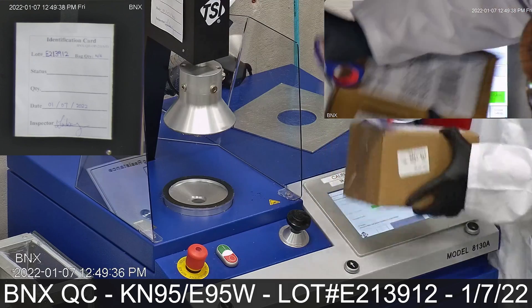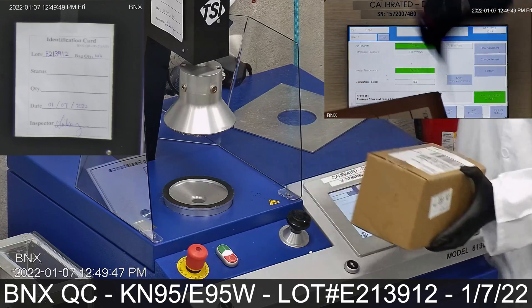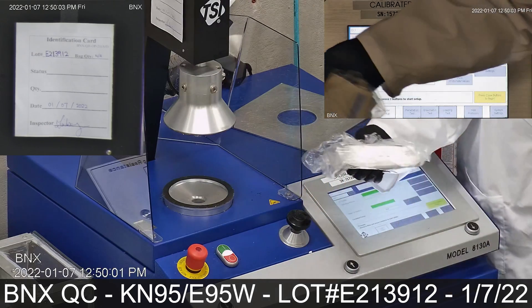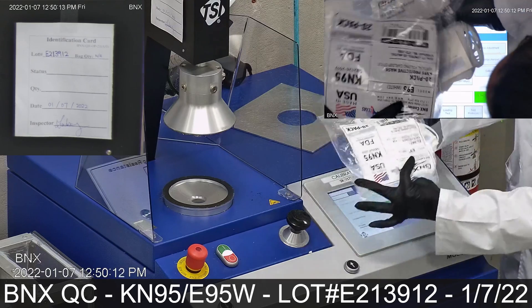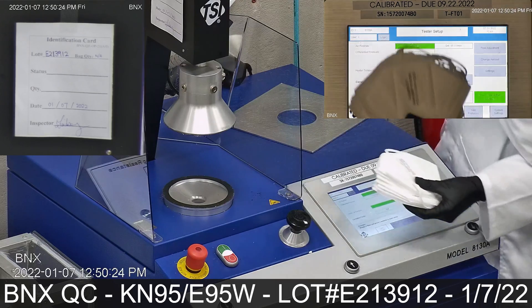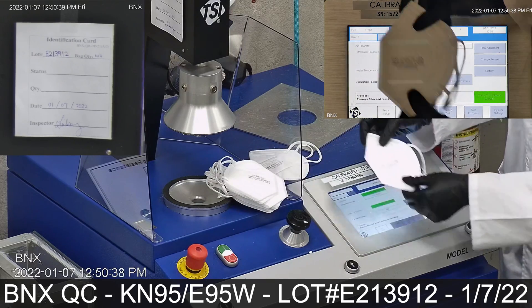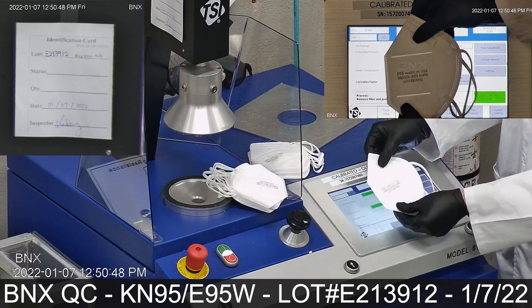Now let's open the box. Today we will be testing these KN95 Vertical Folding Ear Loop Protective Masks, Model E95 White. For verification, the lot number on all of these masks is E213912, as depicted on the screen.